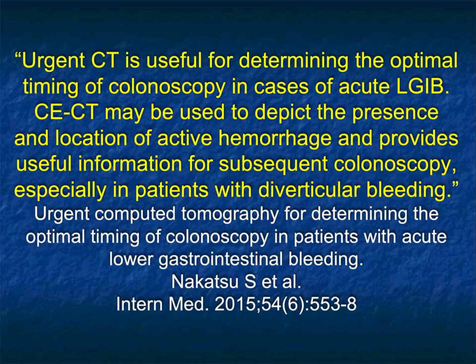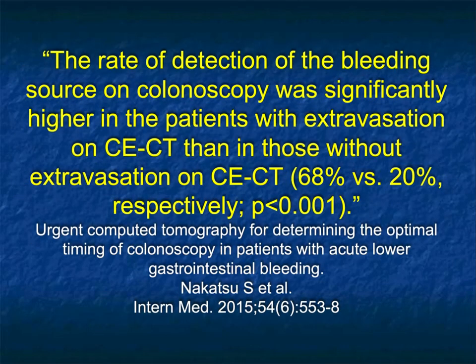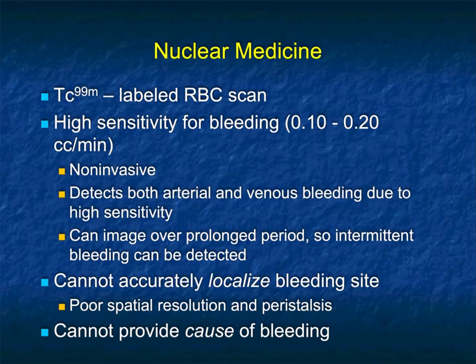What this is saying is we typically or routinely say that you don't do classic angio till you have a positive CT. This article made the point you don't want to do colonoscopy till you have a positive CT, because if you have a positive CT, you know better where to look, and the success of that procedure will be better. Very, very important. The rate of detection of bleeding source in colonoscopy was significantly higher in the patient with extravasation on contrast-enhanced CT than those without extravasation. 68 to 20. Very, very significant numbers.